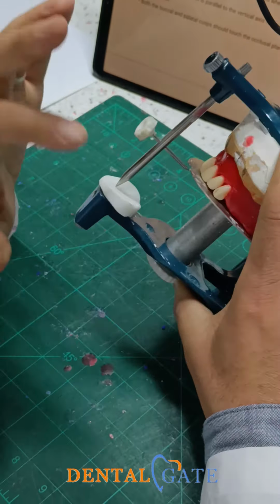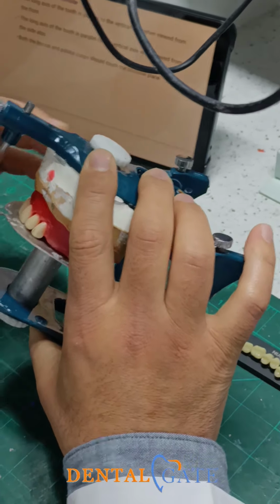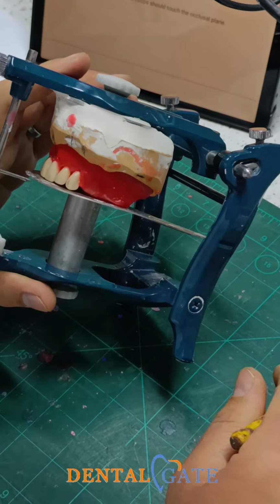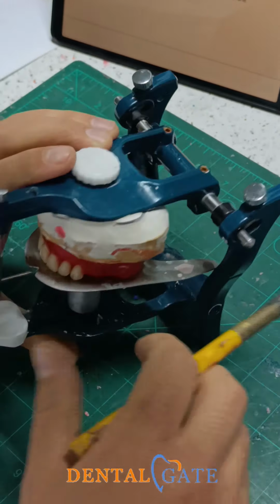So after accomplishing the anterior teeth, we begin to put the first premolar. What's the main criteria of the first premolar? As we said, we need to make it parallel to the vertical axis.